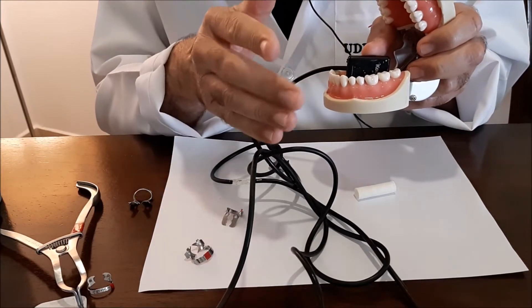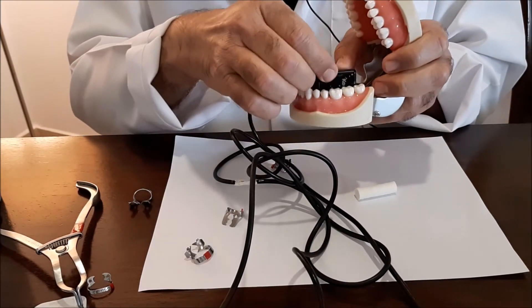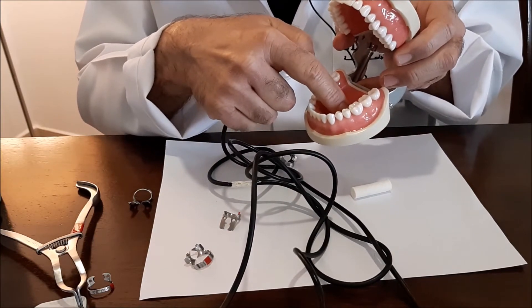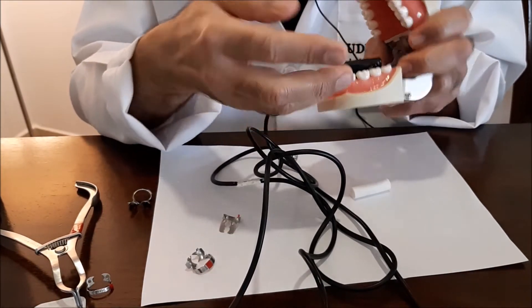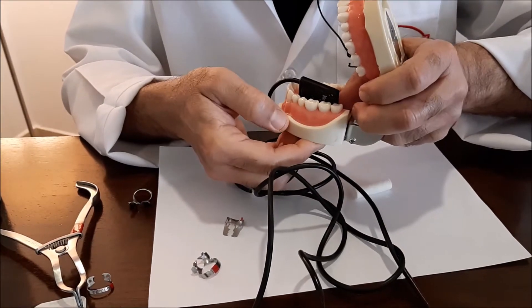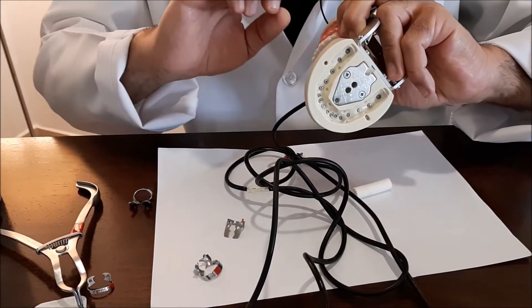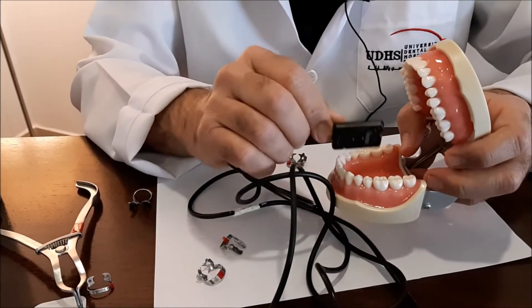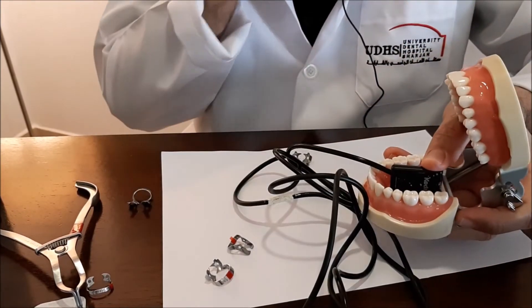You will use your fingers and direct them exactly on the opposite side where the sensor is present. You are going to shift the attention of the patient from this area and the subsequent contraction. The attention of the patient will be directed to that area. You place your fingers exactly on the opposite area where the end of the sensor is present and you ask the patient to please just relax this area. The patient will direct all his senses to your fingers and then the muscle will be relaxed.